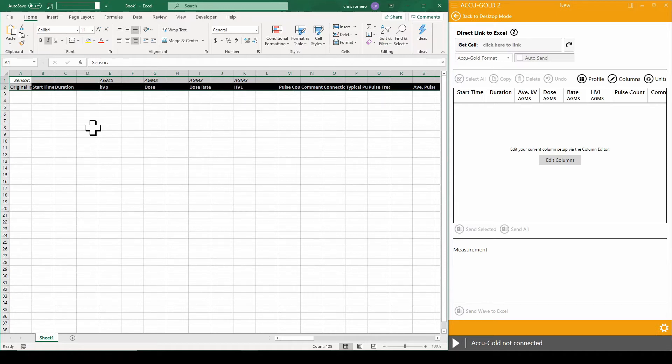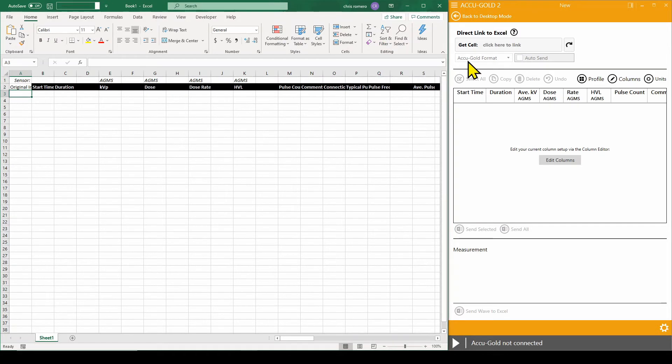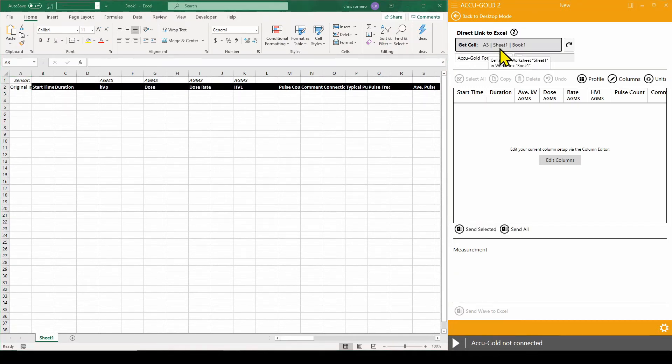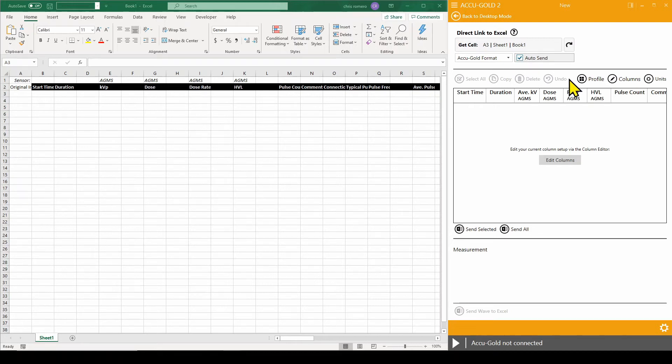We will need to select a cell where we want the data to be placed. After selection has been made, we can go back to AccuGOLD 2 and click the Get Cell button and check the Auto Send box.